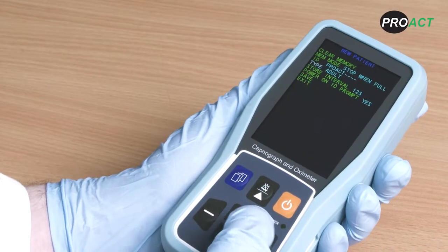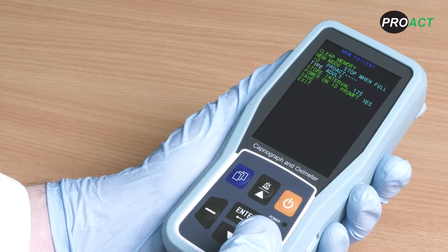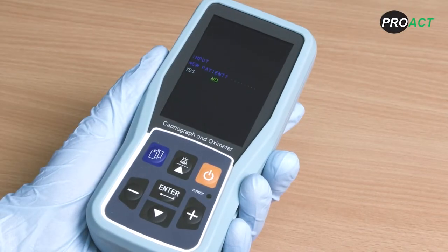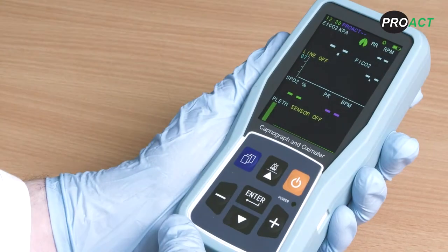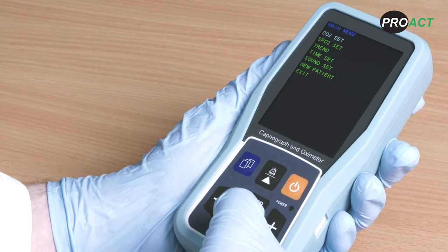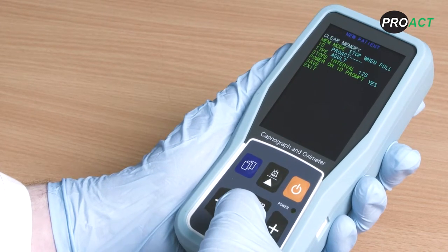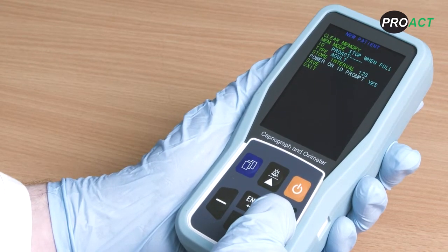For patient type, you can choose between adult and paediatric settings, which have different default alarm settings fully detailed in the user manual. The power on ID prompt will ask you if you would like to input new patient data every time you switch the device on. The prompt is set on by default but you can choose to switch it on and off. If using the device long term on a patient you may want to switch the prompt off; if using it short term and changing between patients, select yes so the prompt appears every time the monitor is turned on.